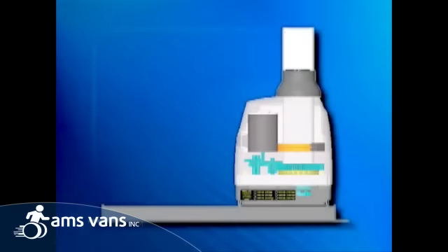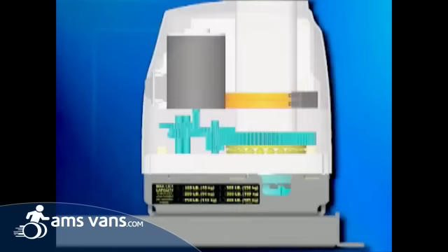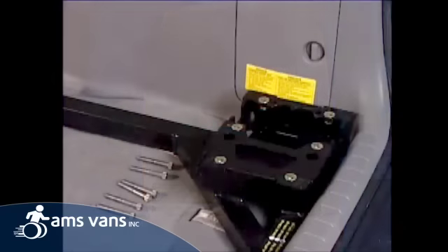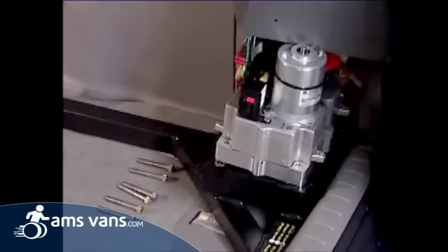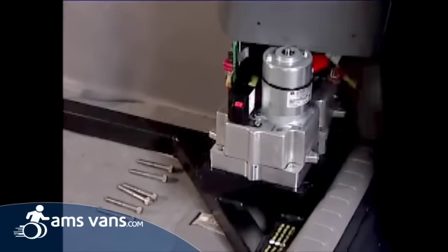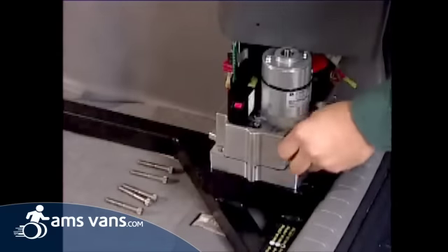The heart of the Curbsider is the self-contained direct gear drive technology. It provides superior performance, and the absence of chains makes it virtually maintenance-free. Six simple bolts attach the direct gear drive to the custom or adjustable sub base, enabling quick and easy installation.